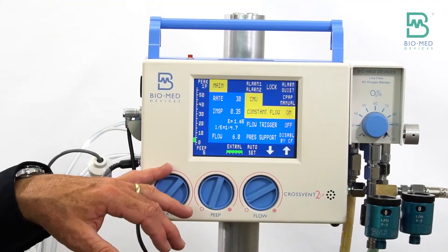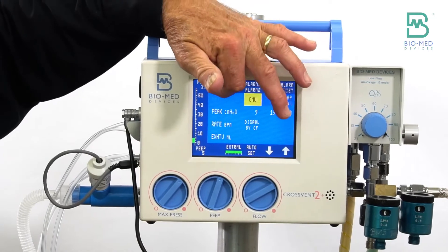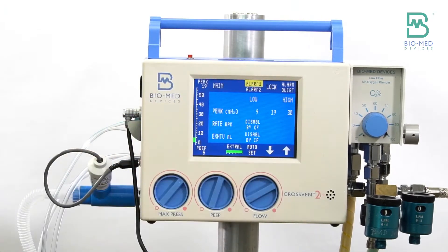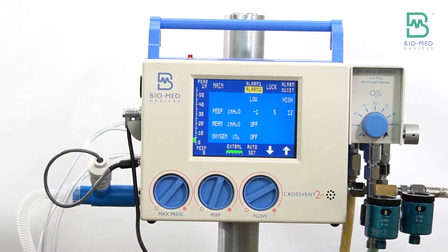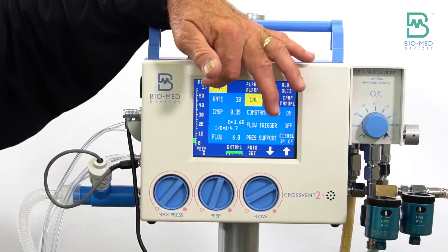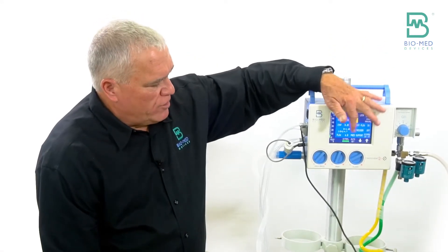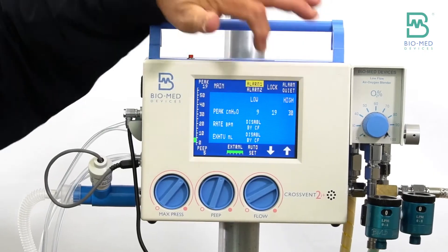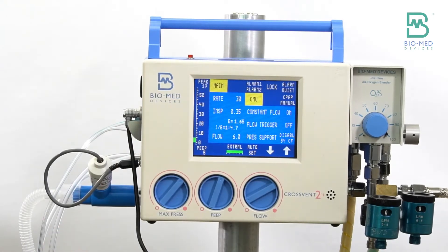After these mechanical knobs, everything works by touch screen. You have a main screen where we'll continue our setup. There are two different alarm screens — it just toggles between alarm one and alarm two. This screen works by pressure. Unlike modern cell phones where you just touch, this actually does require just a little bit of pressure. If you use your fingernail and push, it works.